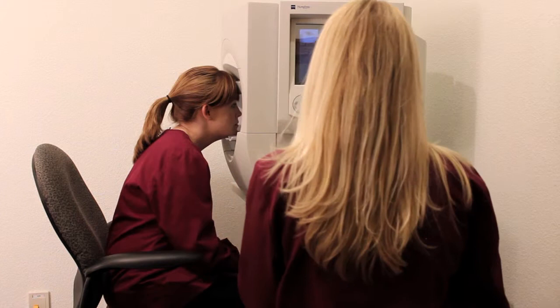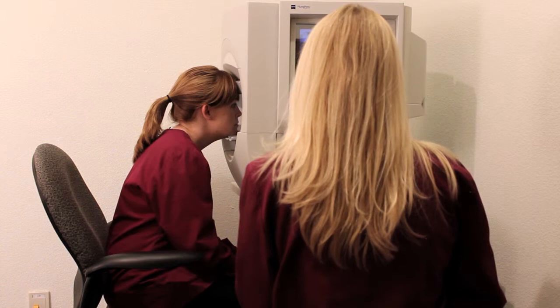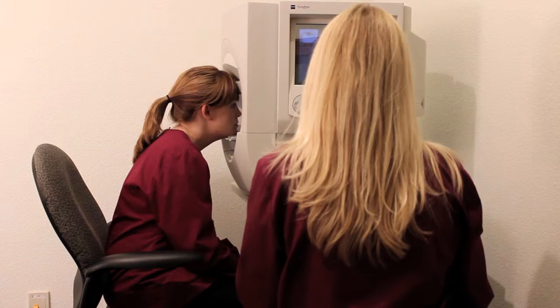Very good. Now, the next time I press the button, the procedure will actually begin. It's going to take on average about five to seven minutes per eye. I will let you know when you are halfway done and then when you have about 30 seconds left. If you need to blink, the best time to do so is just after you've pressed the button. And if you need me to stop the test at any time, please let me know. We'll go ahead and get started. Just look straight ahead, and anytime you see a flash of light, go ahead and press the button.